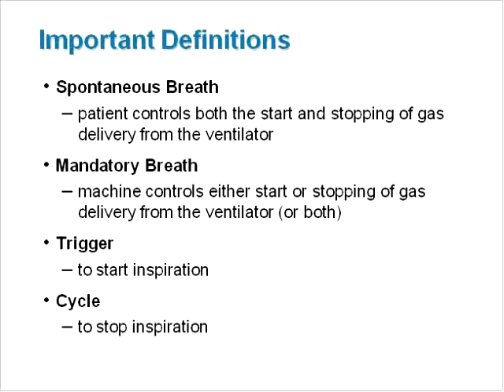In contrast to a spontaneous breath, a mandatory breath does imply connection to a mechanical ventilator. A mandatory breath is one for which the patient has no control over inspiratory time or expiratory time, or both. Also, the terms trigger and cycle are defined here as the acts of starting and stopping inspiration, respectively. Therefore, a spontaneous breath can be defined as one for which the patient both triggers and cycles inspiration. And therefore, a mandatory breath is anything else, namely a breath for which the machine triggers and/or cycles inspiration.